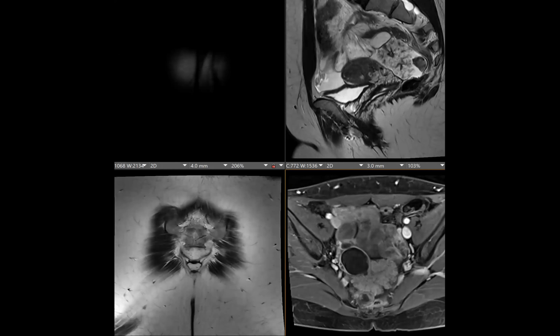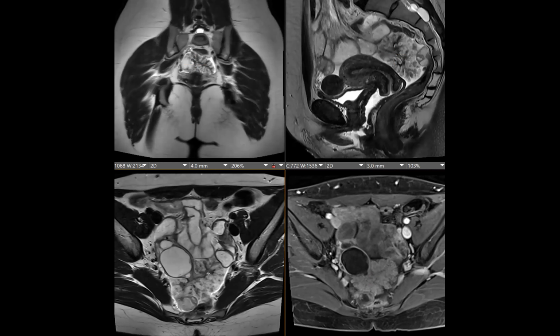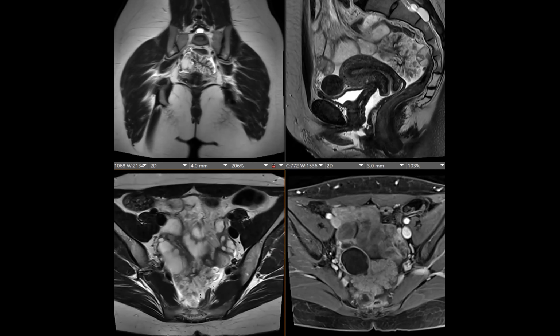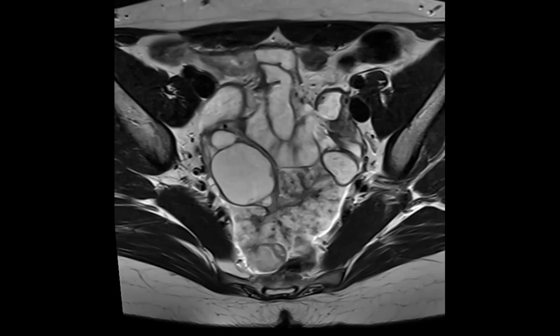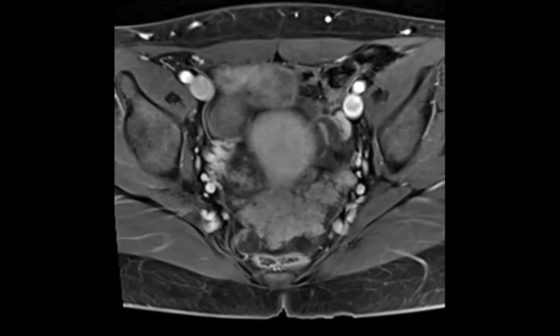Okay, any thoughts? Yeah, an enhancing mass in the presacral area. And are those ovaries hyperstimulated? Like they have lots of big follicles? Yeah, they have lots of big follicles, and there's this polypoid lesion. There's a stalk here that arises from the right ovary. And then you can see this frond-like papillary projection there. And this is what it looks like on the post-contrast. Like you said, it was enhancing right there. Very cauliflower looking.